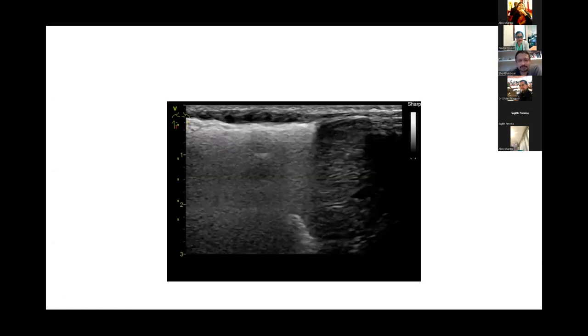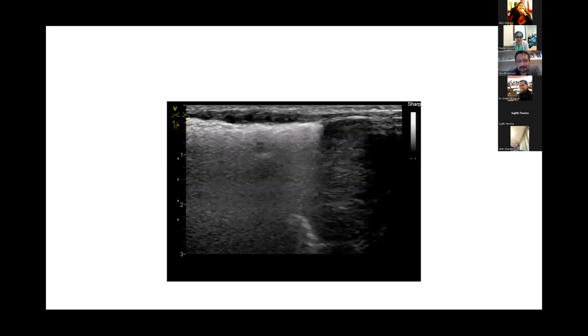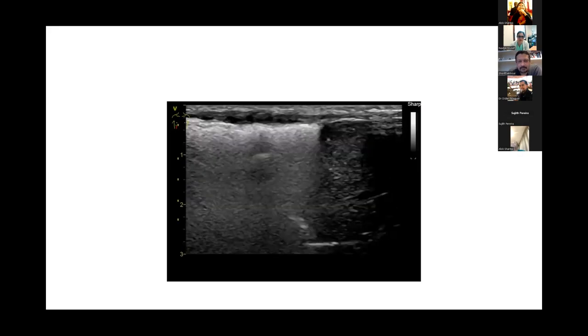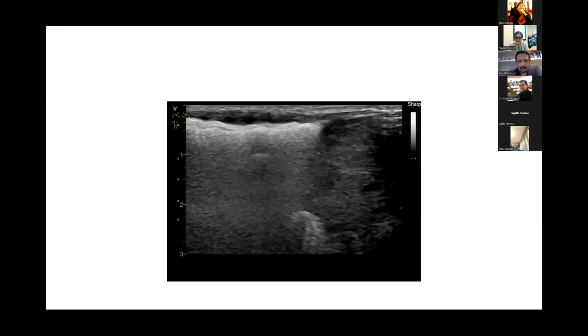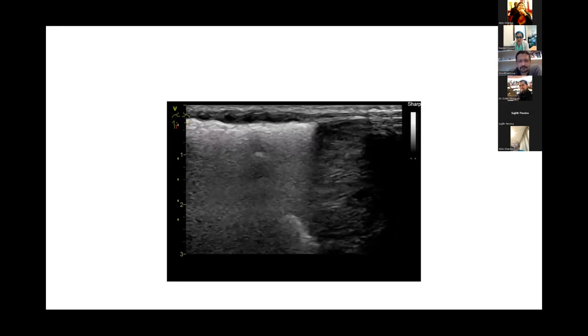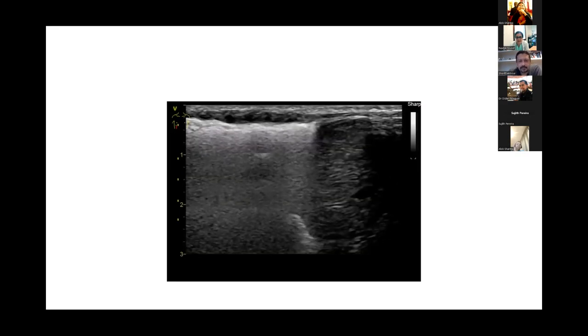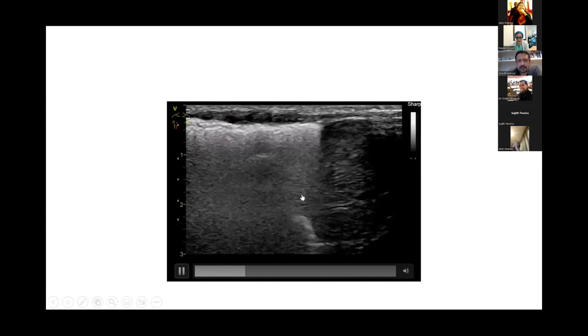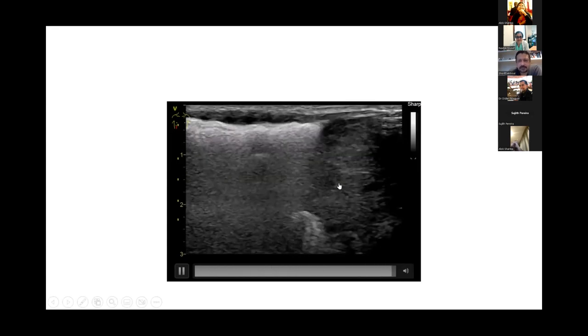What I really like is that you've identified, so we know it's the lung and there is movement, sliding. I do agree with you that the lung surface, the pleural line is thickened and irregular. It's an 8 megahertz probe. So of course we're seeing the images and they're blown up. I guess it's the liver here on the right side of the screen. Yes, correct. And the thing is, I don't really know what we're seeing here.